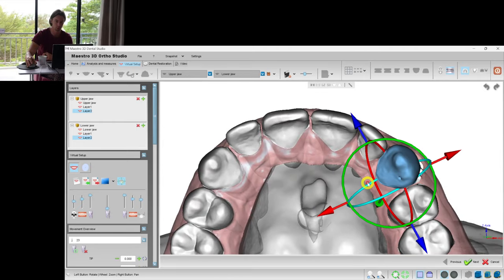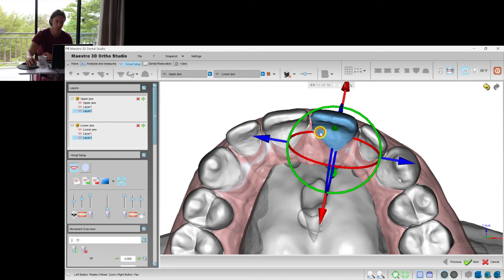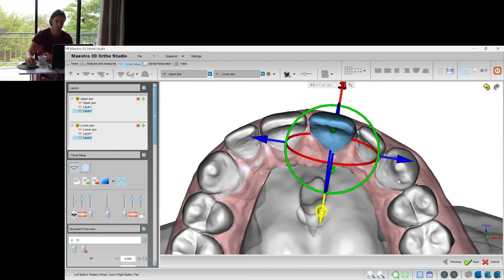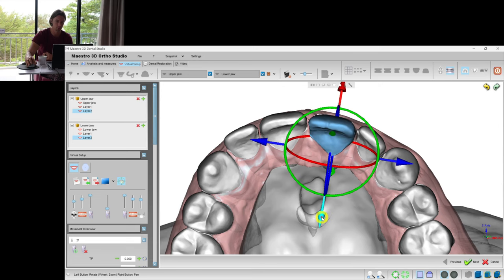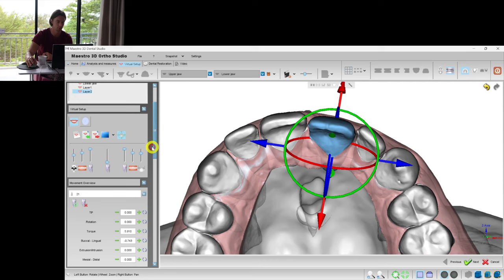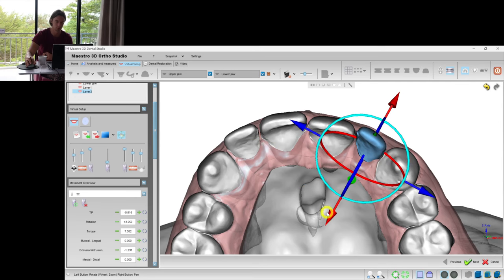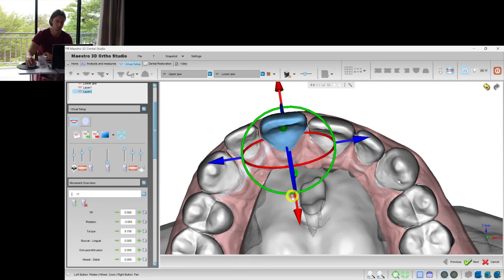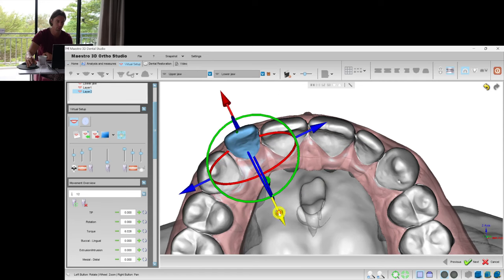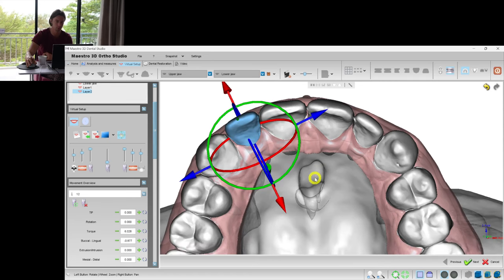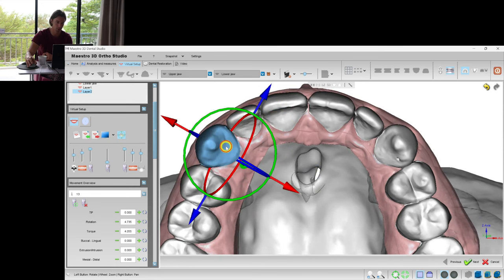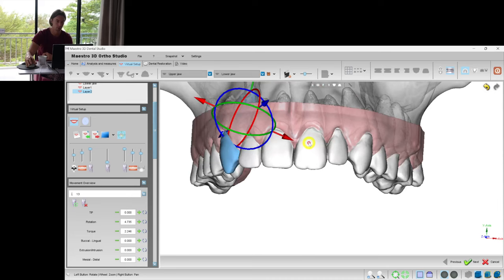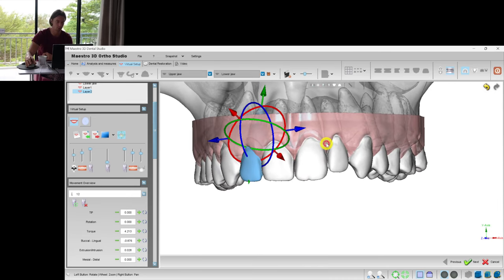And retract the upper teeth. Here in this case I don't want to lose the torque, so I'll move the teeth with a translational movement. But to let it happen, I need to combine it with intrusion or add power ridges. In this case, I will add the intrusion.